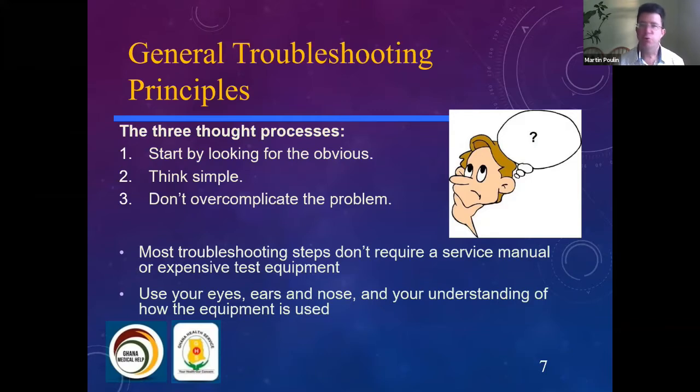Now, most troubleshooting steps don't require a service manual or expensive test equipment. Of course, it's desirable to have those at your fingertips. But if you use your eyes, ears, and nose, and your understanding of how the equipment is used and how it functions, that's your best approach.